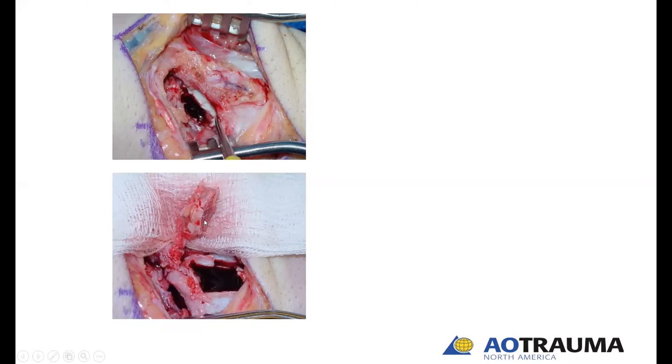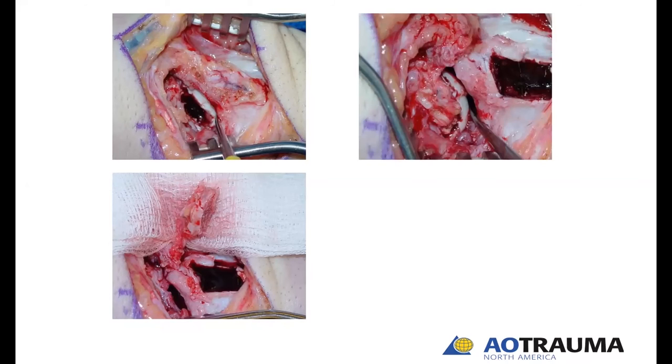You can appreciate we've left a fair amount of soft tissue around those vessels to preserve venous drainage and protect the arterial pedicle. There's a lot of discussion about whether to let the tourniquet down at this point to see arterial bleeding from the graft. I typically don't do that now, although I did it in the first several years until I was confident in the anatomy and protecting the circulation.